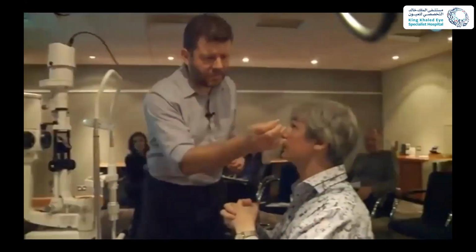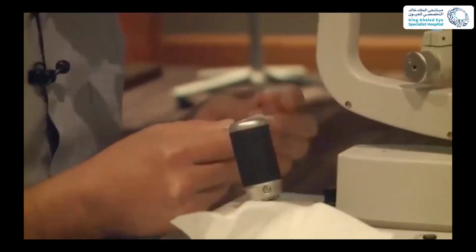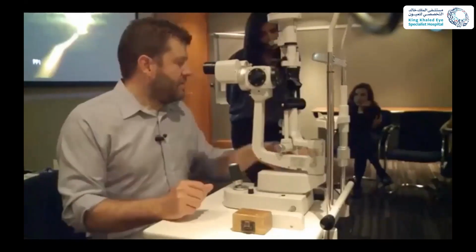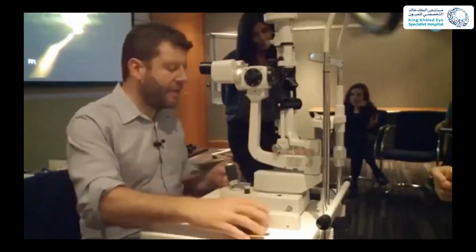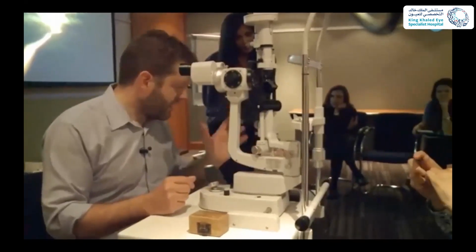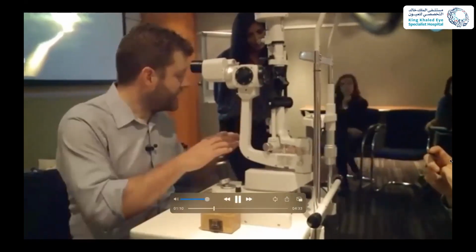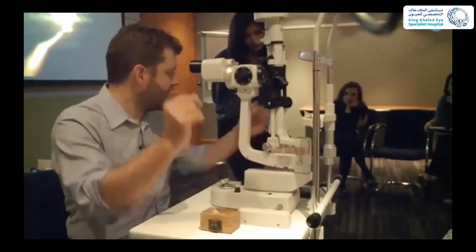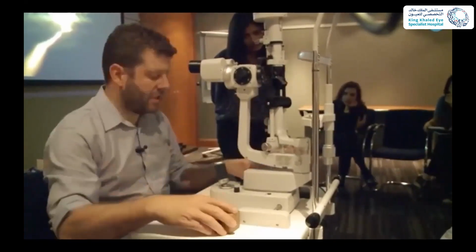The reason we try and minimize the amount of light falling on the eye and have the room lights down is all about maximizing the chances of detecting angle closure. Nothing else. You can see everything you want to see with the lights on. But if you're trying to look for angle closure, you want the pupil to be in its natural, resting, closest to mid-dilated state as you can. And that's really the only reason for turning the lights off.